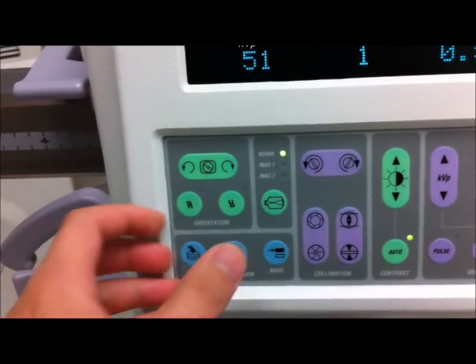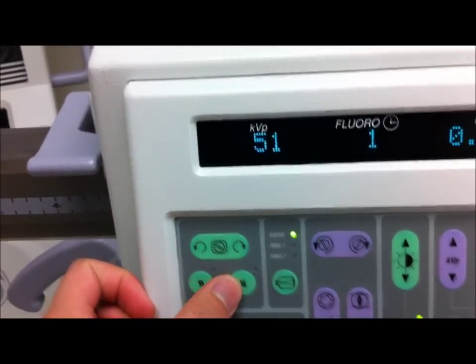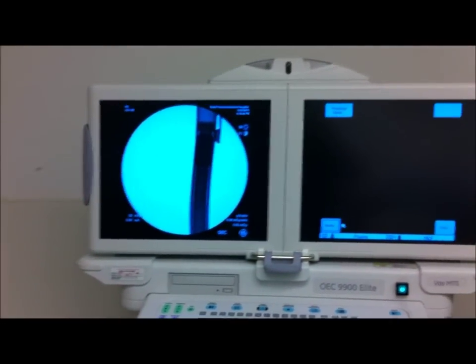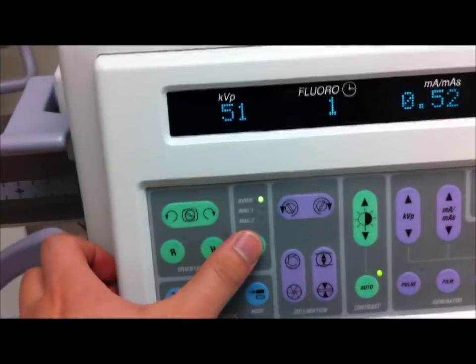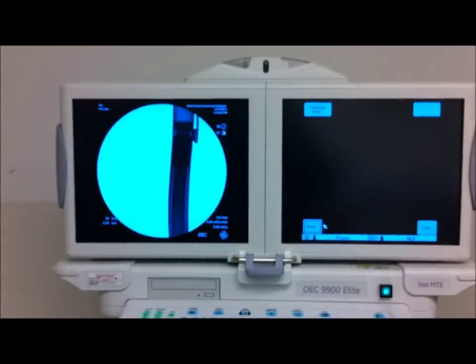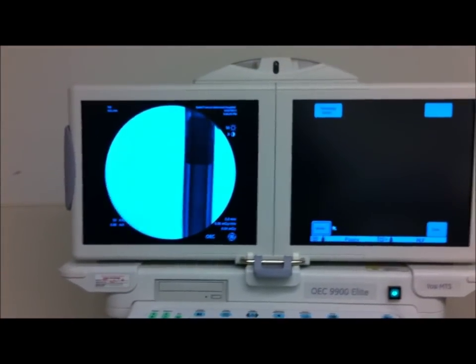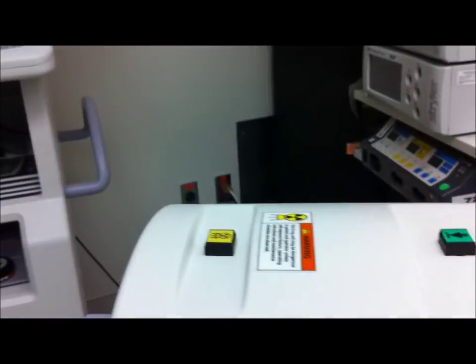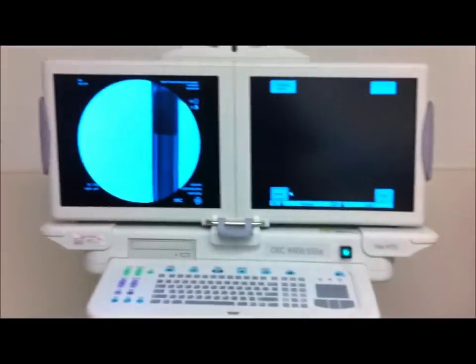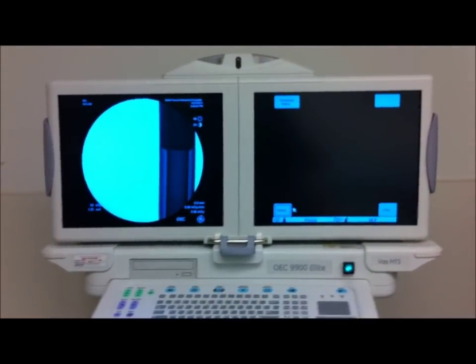Now over here you can reverse or flip the image — see, let's flip it. Over here you have magnification. Mag 1 — if I fluoro again it will enlarge the image, basically magnifying in. And of course Mag 2 is self-explanatory: even more magnification, as you can see.